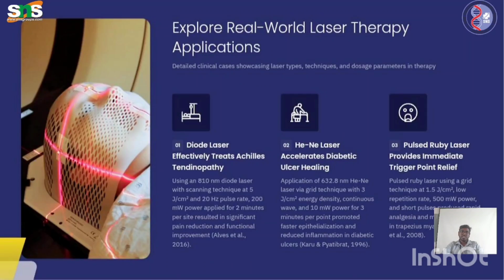The real-life applications are: the diode laser effectively treats Achilles tendinopathy, the helium neon laser accelerates diabetic ulcer healing, and the pulsed ruby laser provides immediate trigger point relief. So these are the general aspects of laser therapy from the electrotherapy point of view.